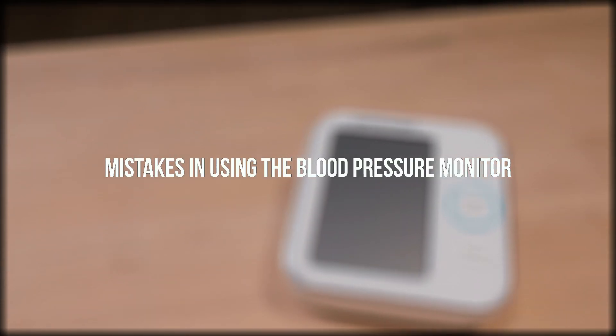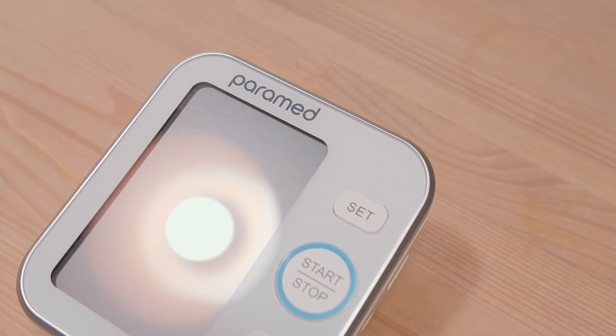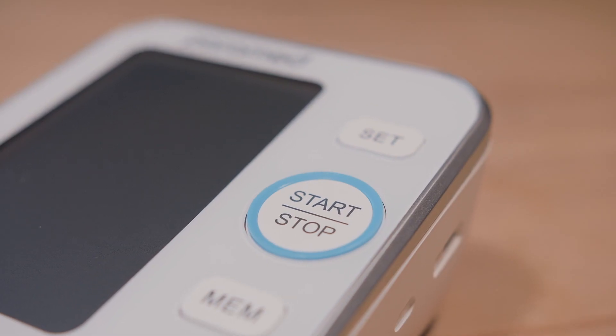Mistakes in using the blood pressure monitor. Pay attention to mistakes which can affect the measurement results. In order for your results to be as precise as possible, please do not do the following while measuring blood pressure.